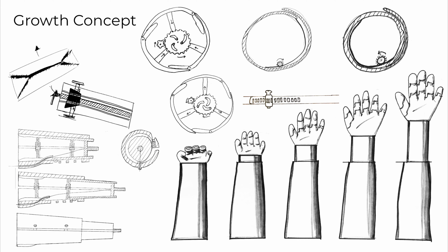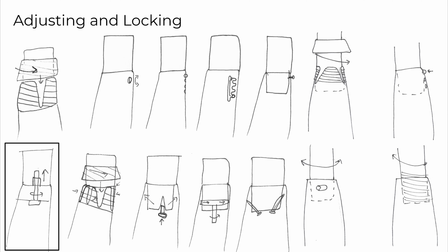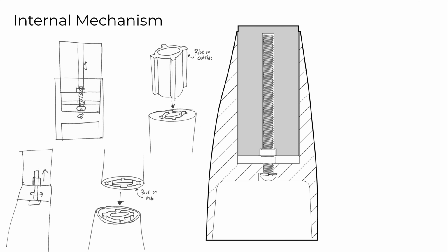We explored various options for extension. After developing a simple way to extend, the prosthetic needed a way to be adjusted and lock at the appropriate length. We explored a variety of different mechanisms that would adjust the length and lock it securely for use. We developed a mechanism that would both fine-tune adjust the extension aspect as well as ensure the prosthetic will not adjust on its own over time.